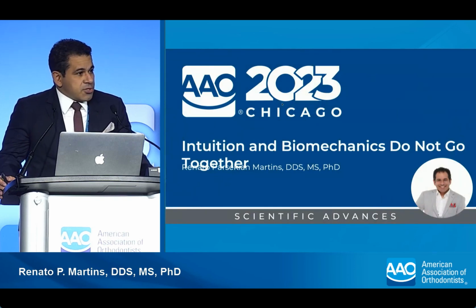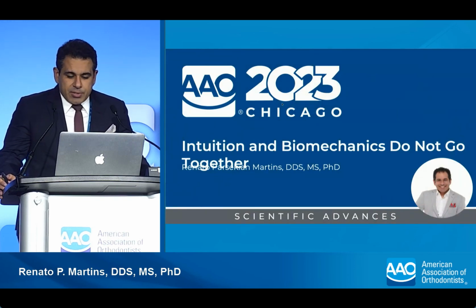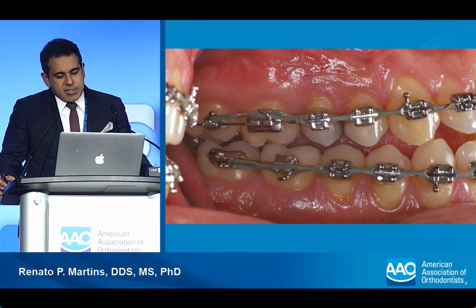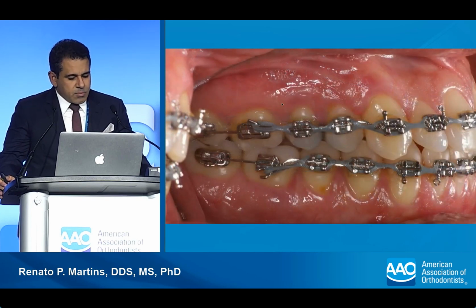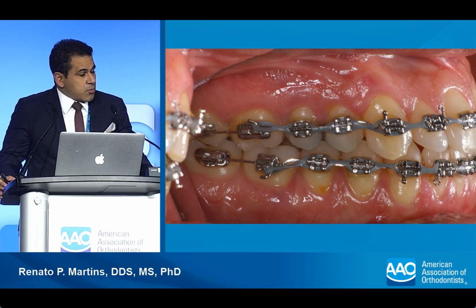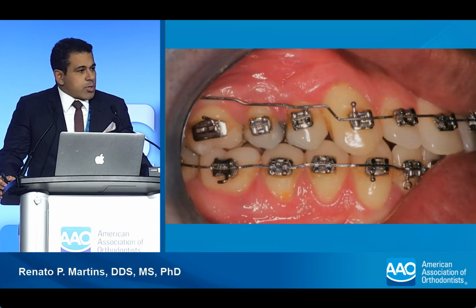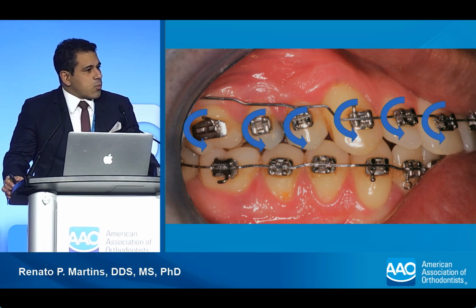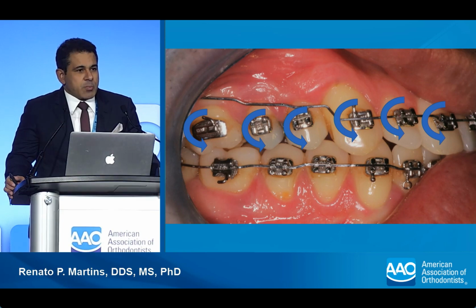So last year in Chicago, we spoke about the correction of open bites and the side effects that we have whenever we're extruding the anterior part of the arch, which of course can be done. We can close bites doing bends, but due to equilibrium, and here you can see the step bends that we placed on this arch wire, we end up proclining the posterior teeth and the anterior teeth. This is a side effect of doing sequential step bends when we're trying to close bites.